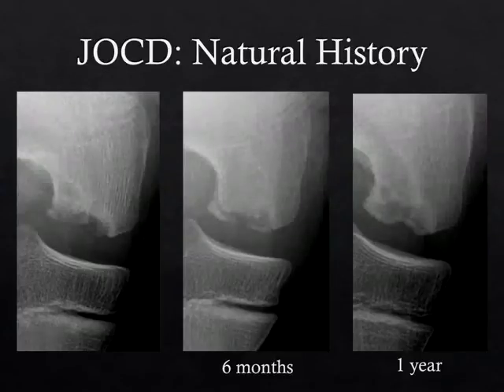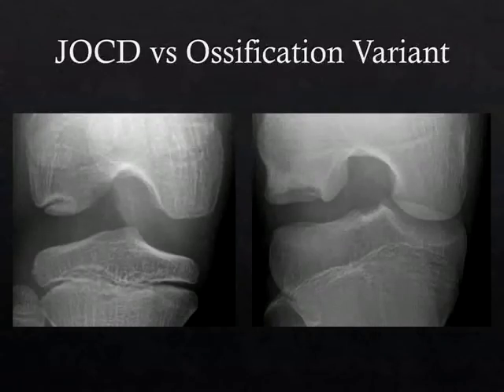The articular surface, or the surface of the subchondral bone, often does not return to a normal contour, but if the overlying articular cartilage is okay, then they're more conservative with the treatment. So obviously, to look at the overlying articular cartilage, you need to do an MRI, which we frequently do.